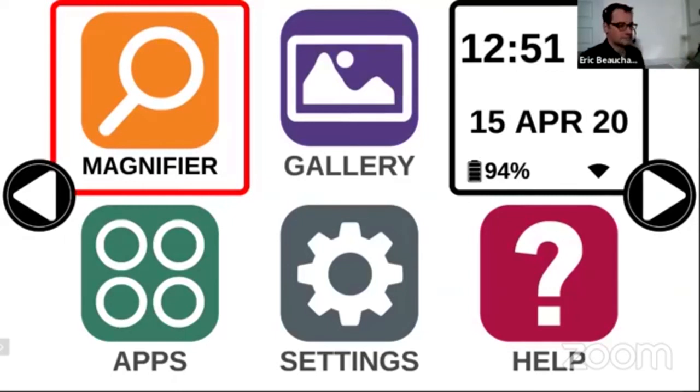Eric, did I forget anything? Nope. And again, that audio feedback is kind of like mimicking the talkback that we have in Android, except that, as some people just mentioned, we can't use talkback, let's say, when we're editing a document or annotating a document.